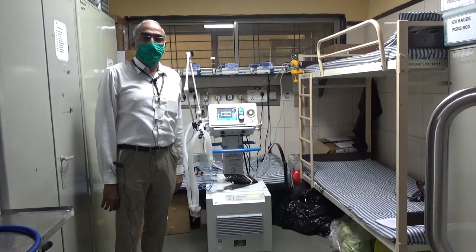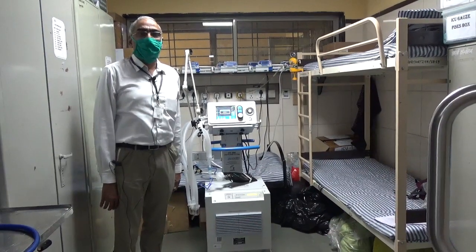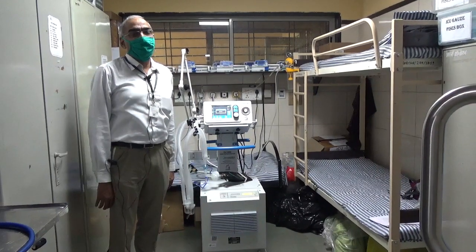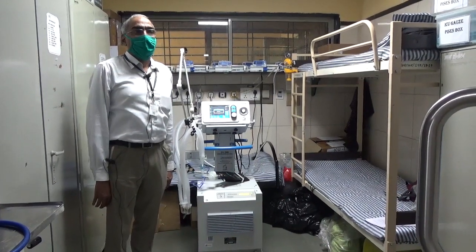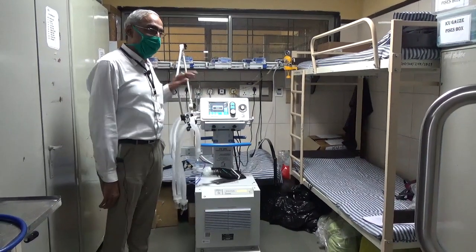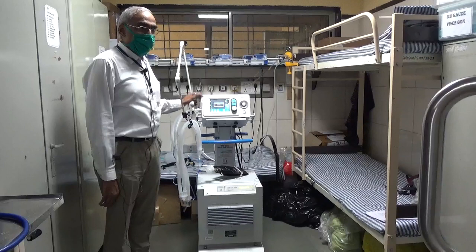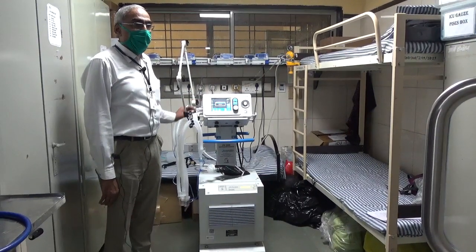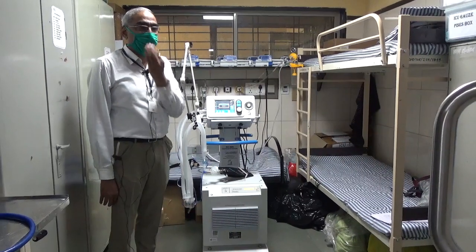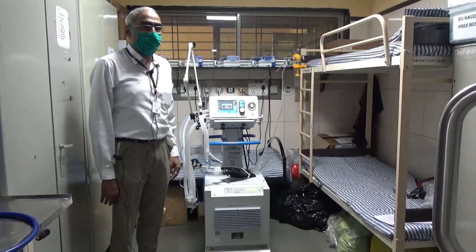In the third video of this series on mechanical ventilation, I am going to discuss non-invasive ventilation. Non-invasive ventilation is the use of the same ventilator that you have seen, the CV200, but it is used not along with an endotracheal tube, but with a face mask. And this face mask fits tightly.